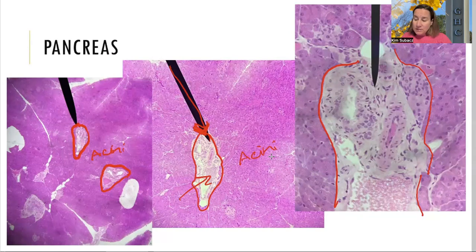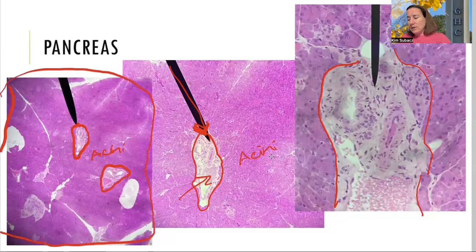Be able to recognize the pancreas, know what you're looking at. If you see something like this, this is the pancreas, and know that the pancreas is both endocrine and exocrine. And specifically for this exercise, we are looking at its endocrine properties. So we want to know all about this light pink section called the islet of Langerhans.